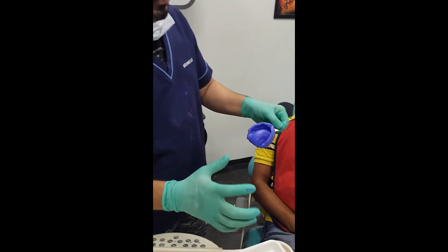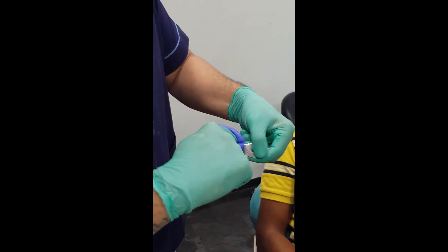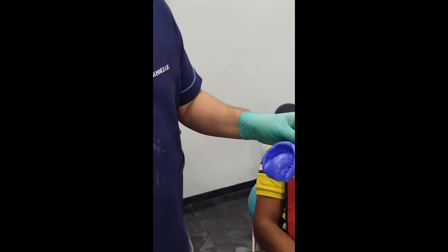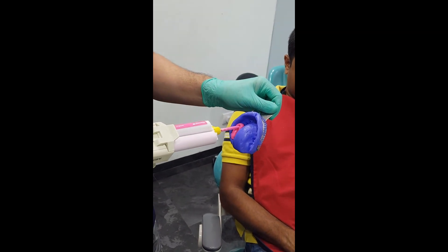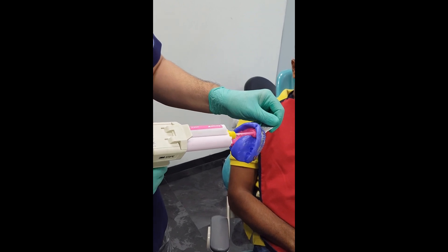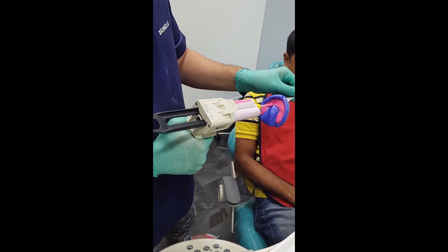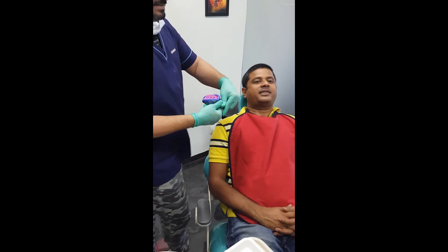That is what I have gotten. I take my index finger and pinch the material inwards, as if removing all the interdental papilla, and I push the vestibular flanges outwards. Remember the material is not set. I take my light body and dispense it all the way from one surface without lifting at all towards the other. It's important to use a light body that has good flow properties. I'm going from one side all the way to the other, and I also place a little on the palatal portion. Then take it back into the patient's mouth and seat it down.